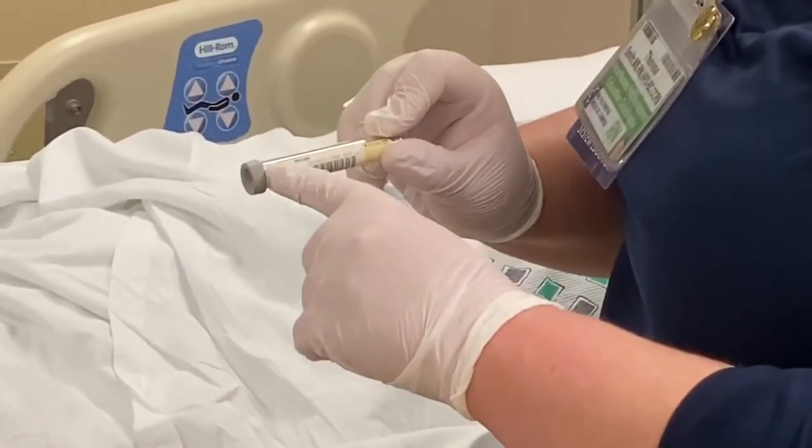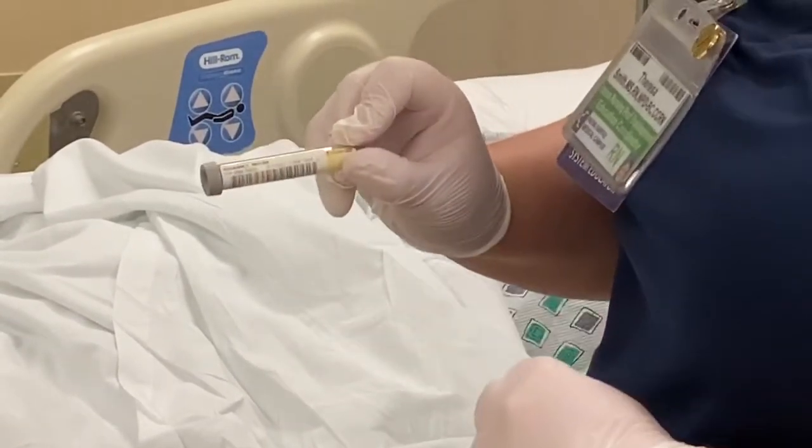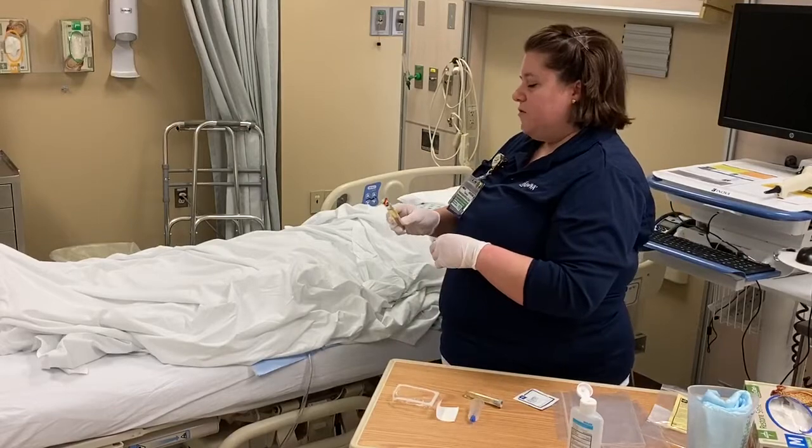So I have my patient's name towards the colored part of the tube, and it's up nice and high so the lab will be able to see it. Then I'm going to take my yellow and red label and label my yellow and red tube.